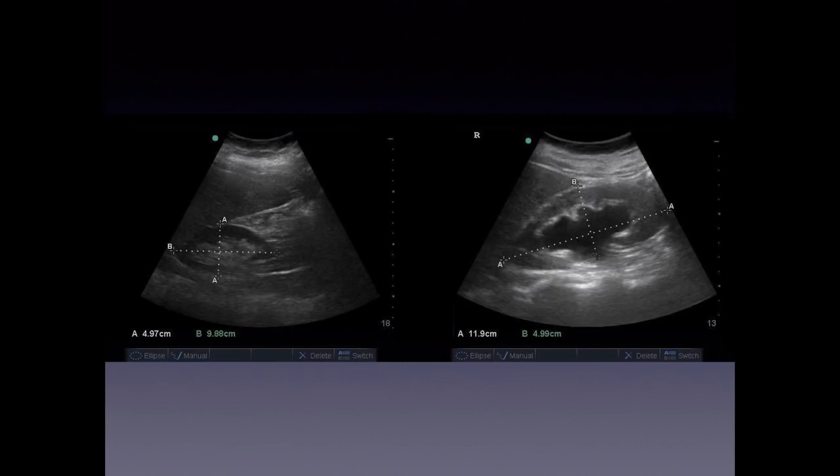When comparing both sides, you can see that the right kidney in this example has hydronephrosis present compared to the normal-appearing left side.